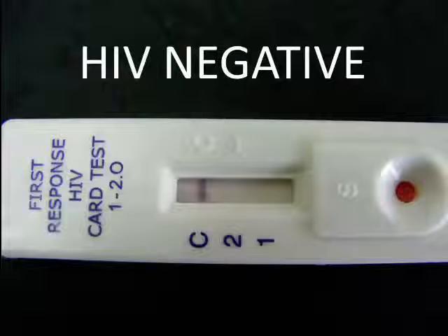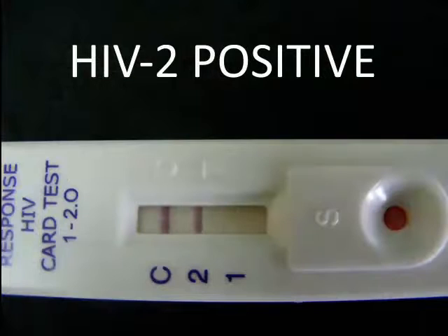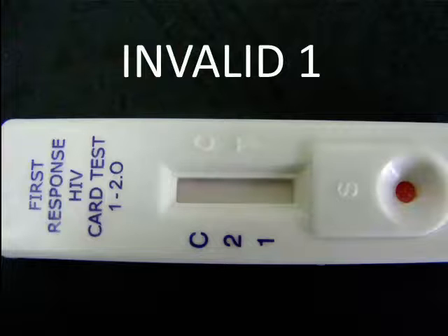The presence of only one band within the results window at the control line C region indicates a negative result. If two colour bands appear — one for control and the other for HIV 1 — the specimen is reactive for antibodies to HIV 1. If two colour bands appear — one for control and the other for HIV 2 — the specimen is reactive for antibodies to HIV 2. If three colour bands appear — one for control and the others for HIV 1 and HIV 2 — the specimen is reactive for antibodies to HIV 1 and 2. If no colour band appears in the control region within the stipulated time, then the result is invalid.